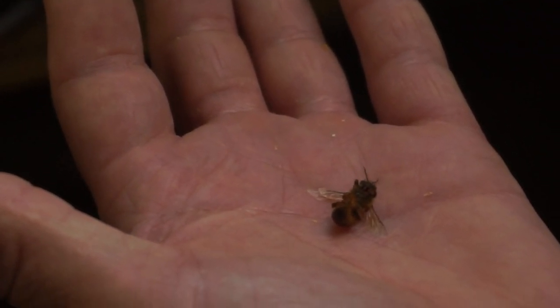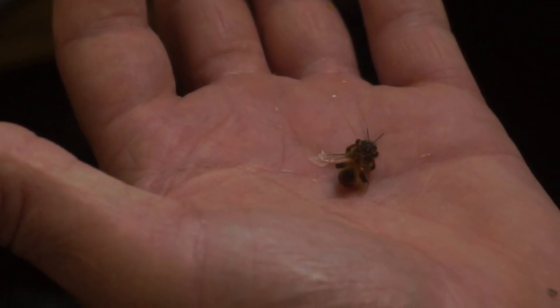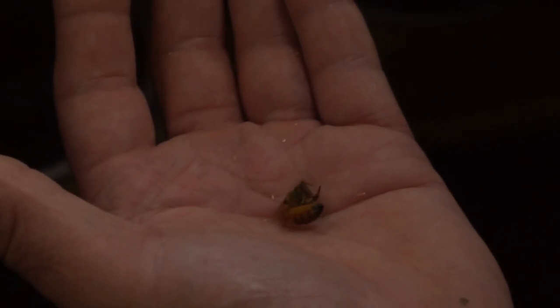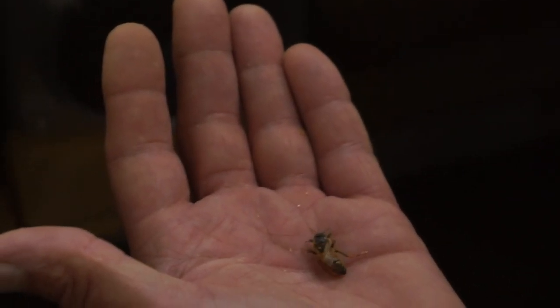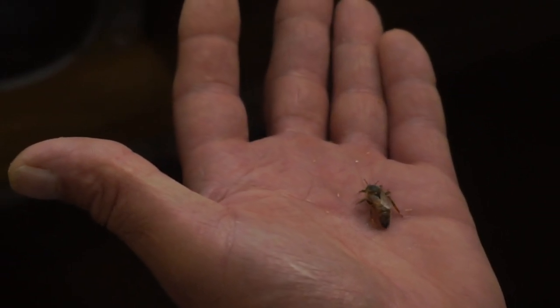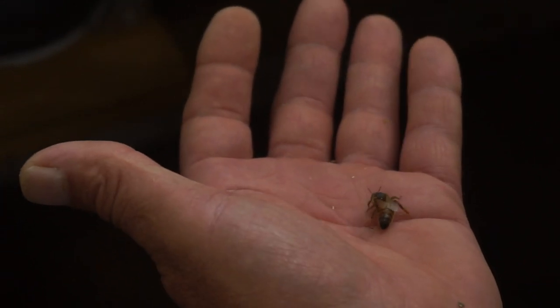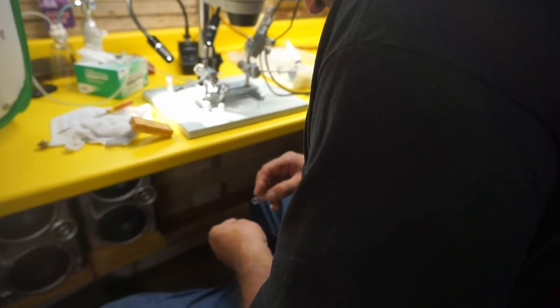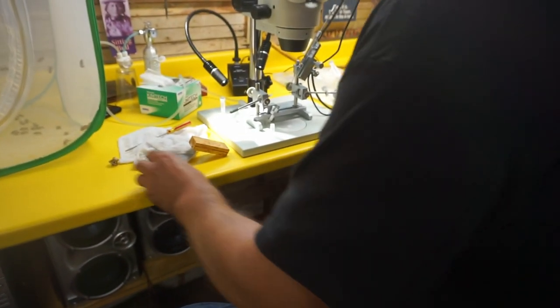She looks, she's coming back. The CO2 looks like it's bubbling out. So you've seen them faint before? I've never seen a queen faint. Yeah, she was knocked out there. There's a slow trickle going on here. But I've had queens faint on. Okay, she's back again. Look at that. She was totally knocked out. That was a good one. Oh, now she's getting more alive.